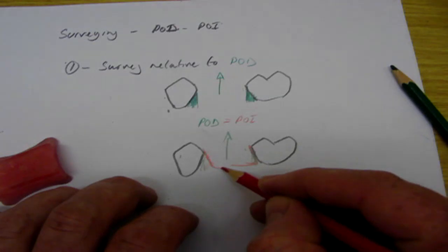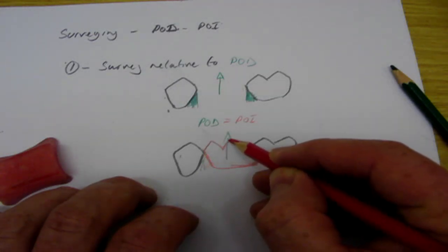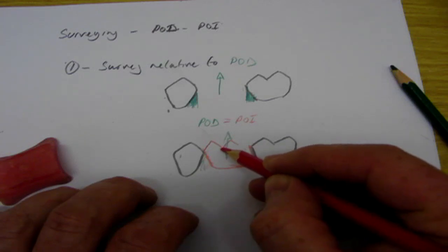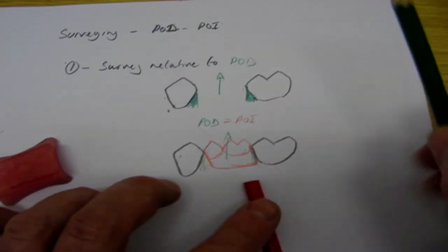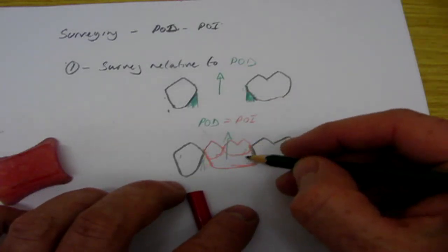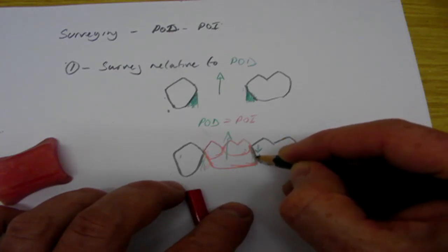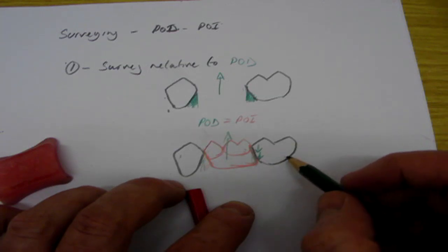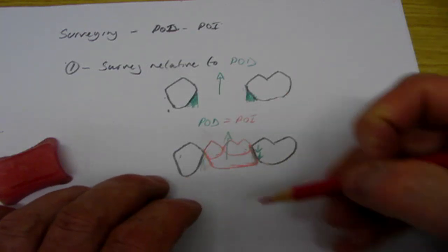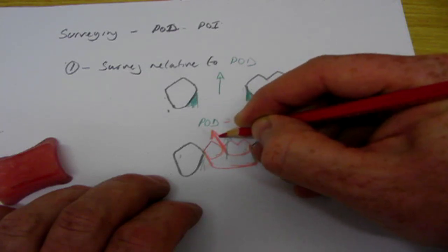Okay, and then when we do that, all this area here needs to be blocked out, and then we put our teeth on like so. And now we've created undercut, and now we have gained retention by engaging this undercut mesial to the molar. Okay, and this is now our path of insertion down in this direction.